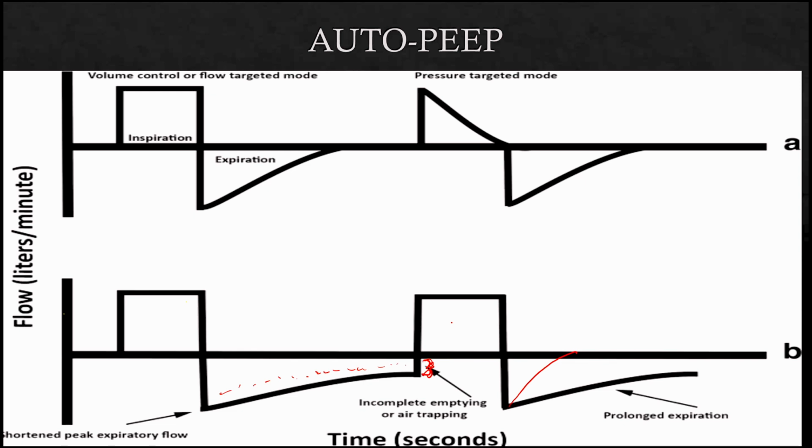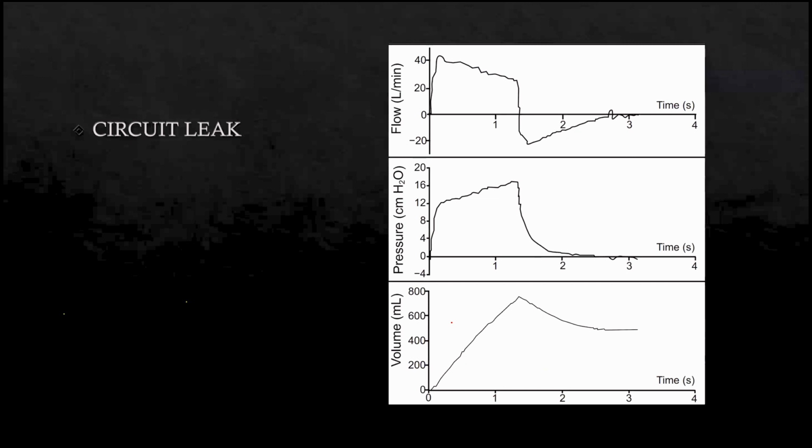So though I have told you that expiration is the main problem, if you get into the basics of the mechanics of COPD or ventilating these patients, we also know that these patients have poor compliance because of the FRC increasing. They have difficulty in triggering the breath, etc. So that is a different sort of talk altogether. But the basic problem here is the expiratory prolongation, and everything else follows as a cascading effect. That can be picked up by just looking at the flow time curve, where the expiratory limb doesn't touch the baseline, as you can see in this figure.